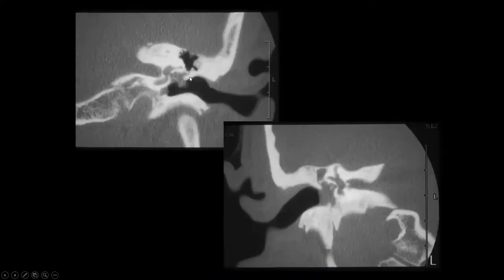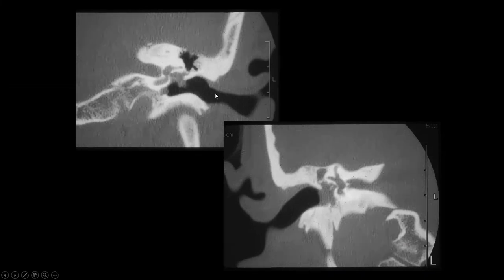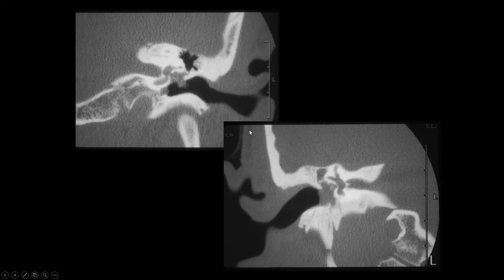Another example shows the scutum and Prusac space with no middle ear ossicles identified, and the facial nerve canal possibly involved as well. In yet another case, there is a blunted scutum and partial middle ear ossicle — specifically the incus with erosion of the long process of the incus — along with soft tissue in the middle ear cavity.